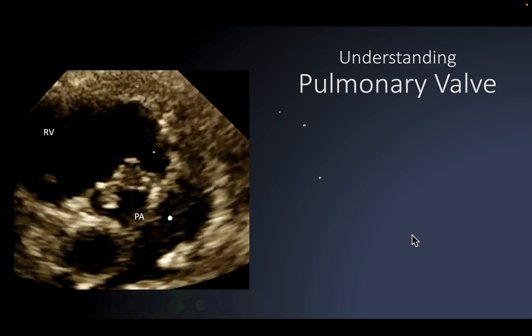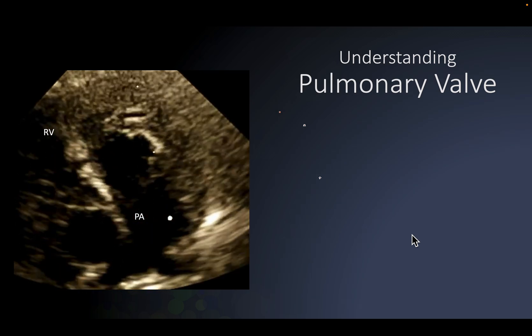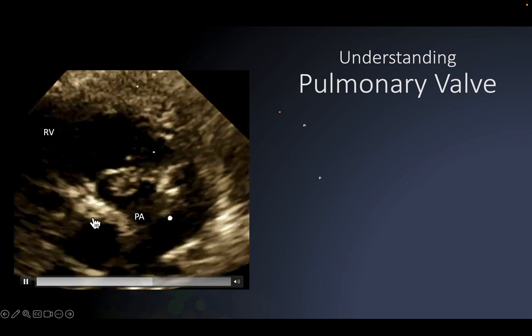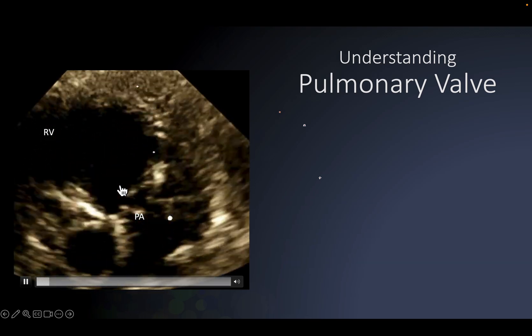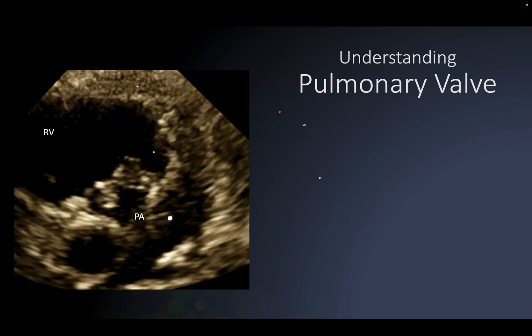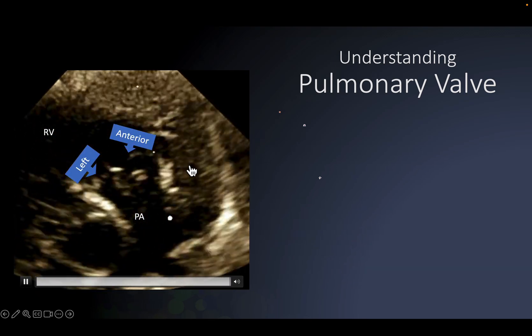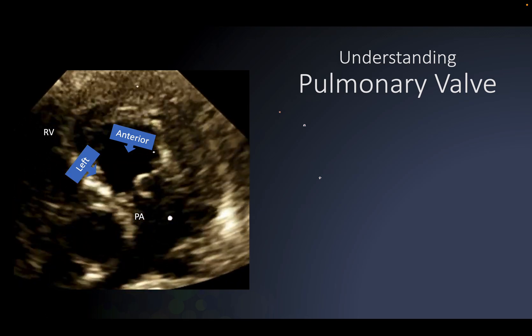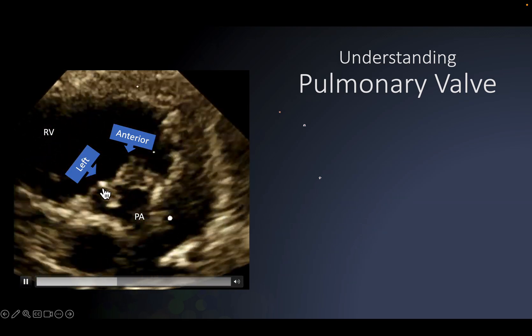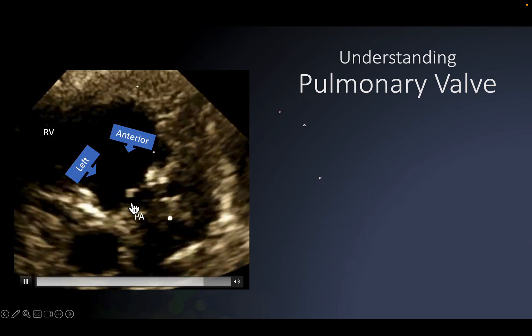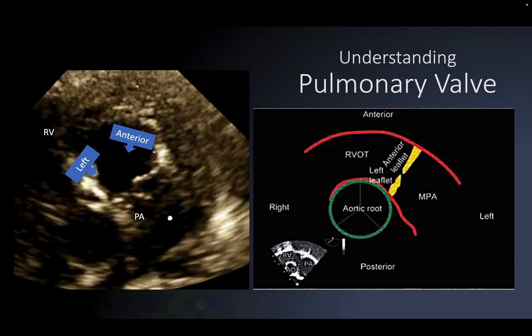Understanding the pulmonary valve - let me give you another dimension. This is a patient with pulmonary stenosis. This is a zoomed view showing the right ventricle, pulmonary artery, and the pulmonary valve which is thickened and doming. The leaflet lying on the left side of your screen is the anterior leaflet of the pulmonary valve, and the one lying close to the aorta is the left pulmonary valve leaflet. The right pulmonary leaflet lies behind in a different plane.